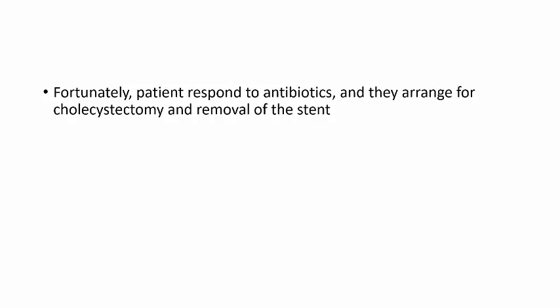At the beginning we give only analgesic, after that we did stenting to the common bile duct, and at the end we did aggressive antibiotic and arranged for cholecystectomy. And this is the power of point of care ultrasound in your hand, with management of your patient in the clinic.